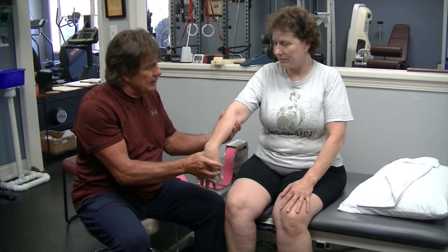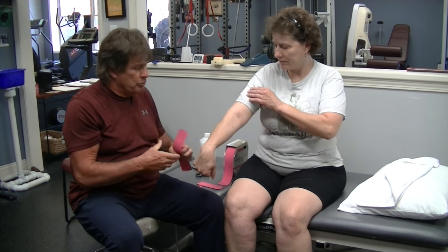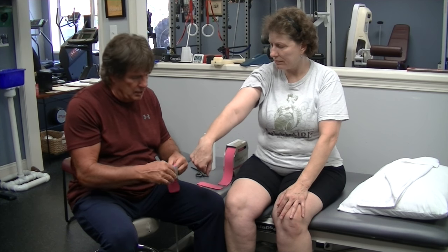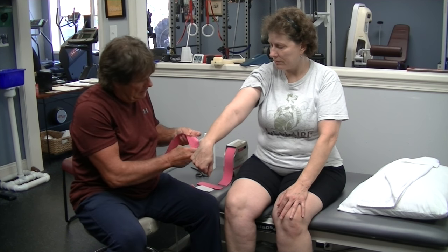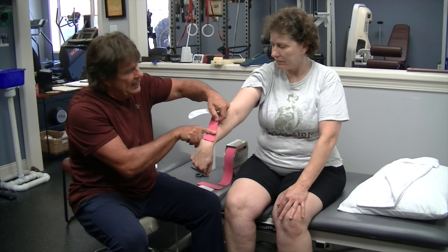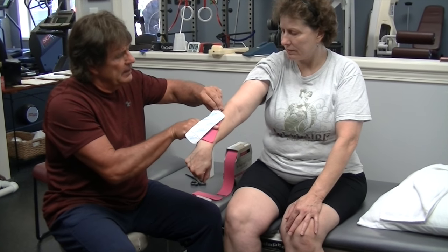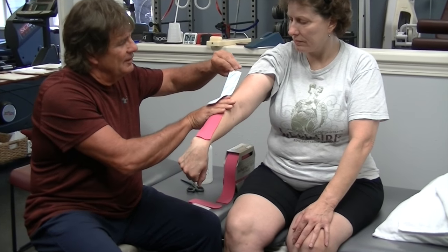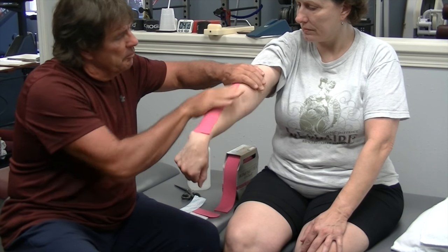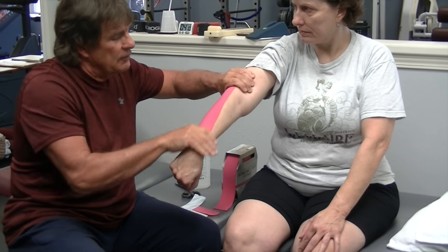So Katie here is going to take and straighten her elbow and bend her wrist down. I have pre-cut the strips. So I'm going to peel the tape from the backing and apply it right at the base of her wrist and just let it run up her forearm. Smooth it out as we go. I want to put a few rubs on it because the heat from that helps activate the adhesive.